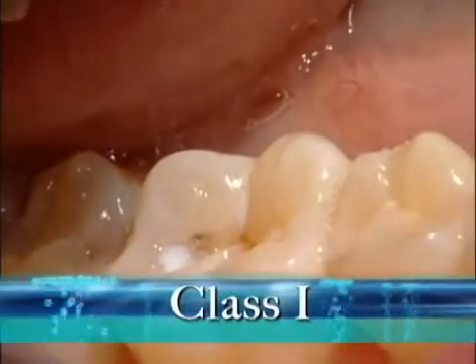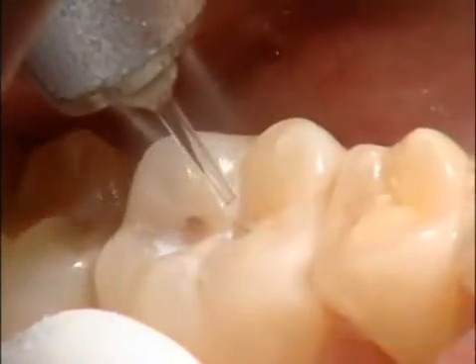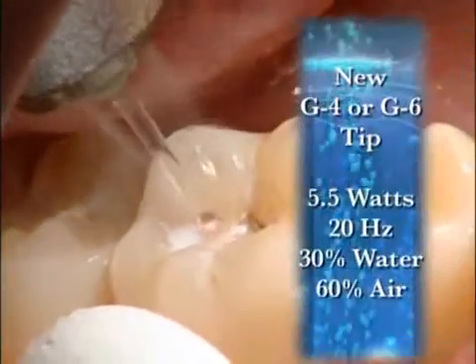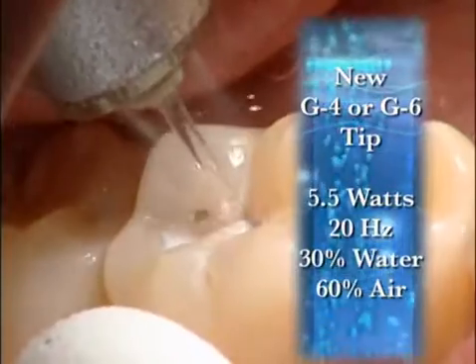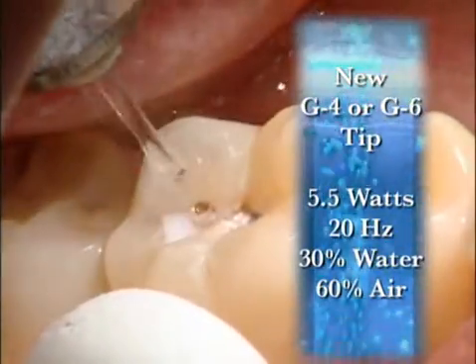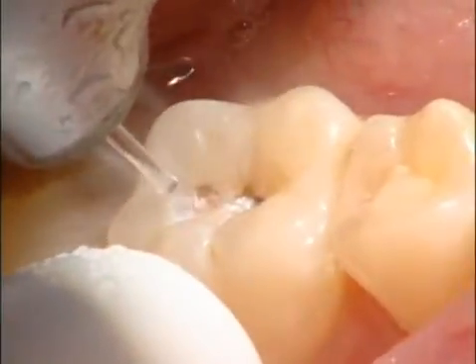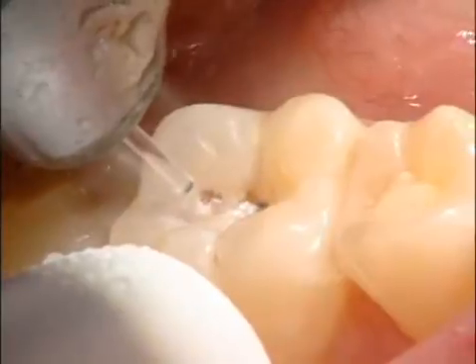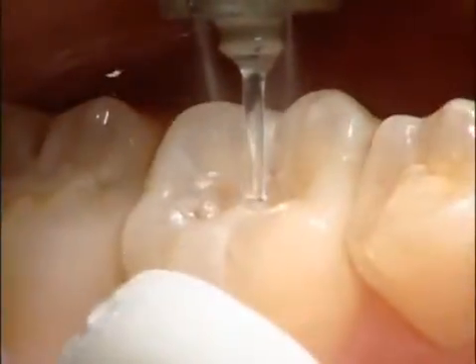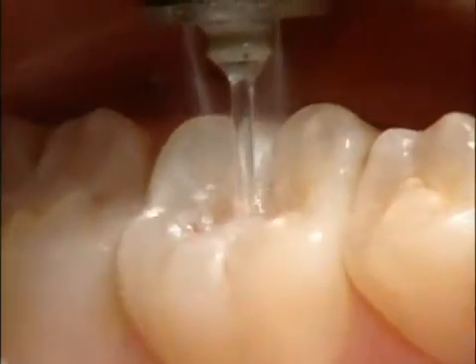So the first thing we're going to do is laser anesthetic. You want to use a brand new G4 or G6 tip. We're going to be at 5.5 watts, 30% water, 60% air, 8 to 10 millimeters away from the tooth structure at 20 hertz. And you need to hover 8 to 10 millimeters away for a minute and a half to 2 minutes.